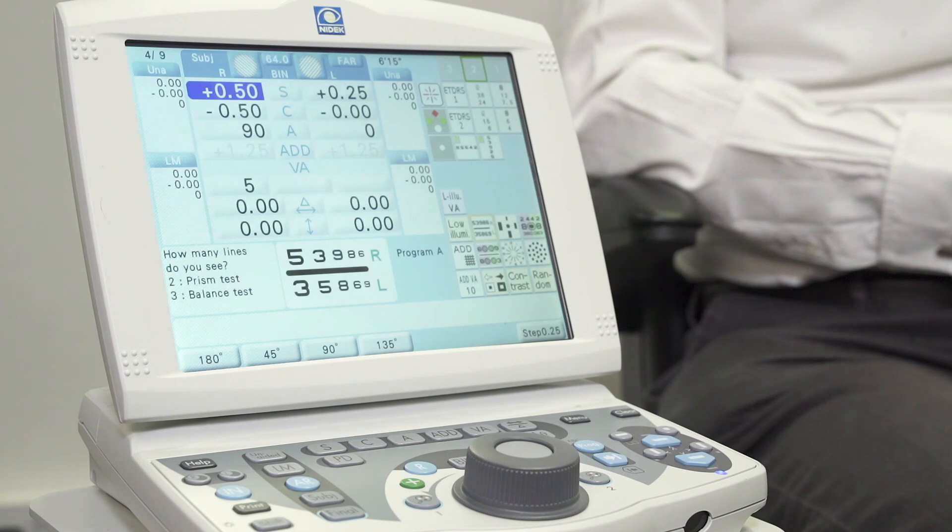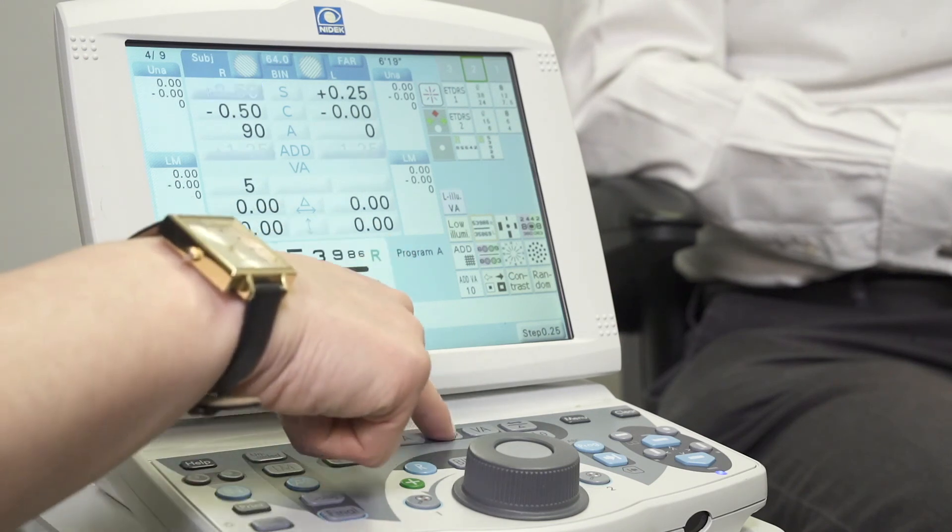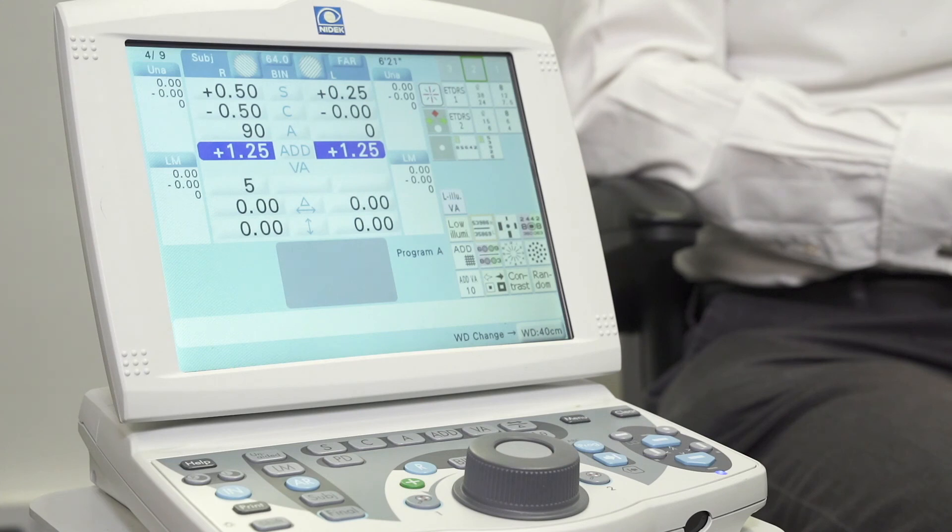Once we're happy with our distance prescription, we can move on to check our near visual acuity using our add function here and the reading rod attached to the top of the phoropter head.